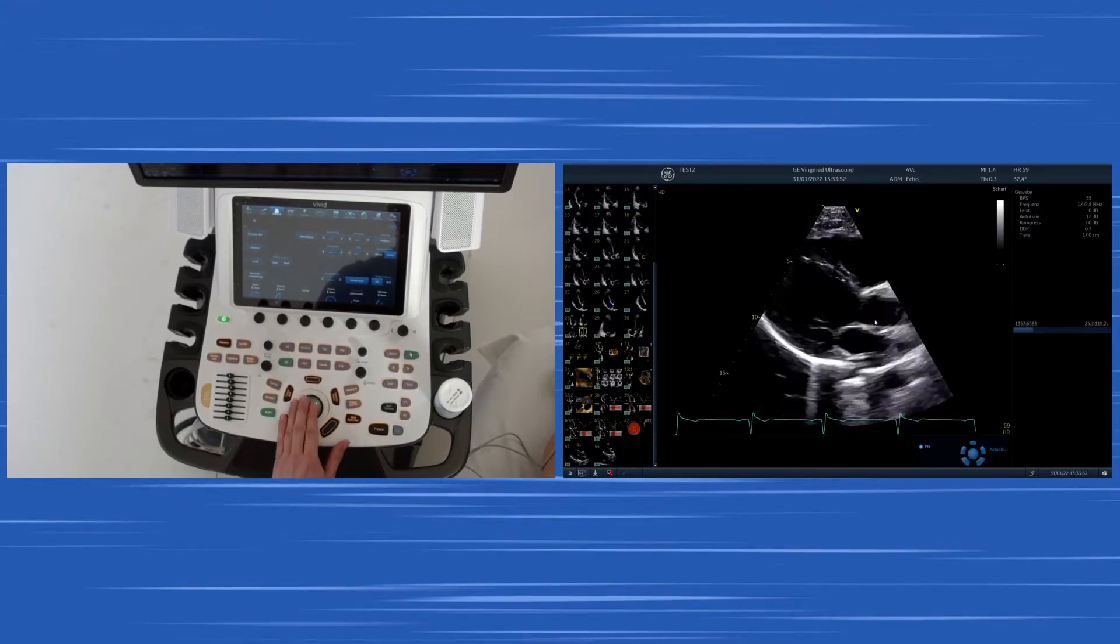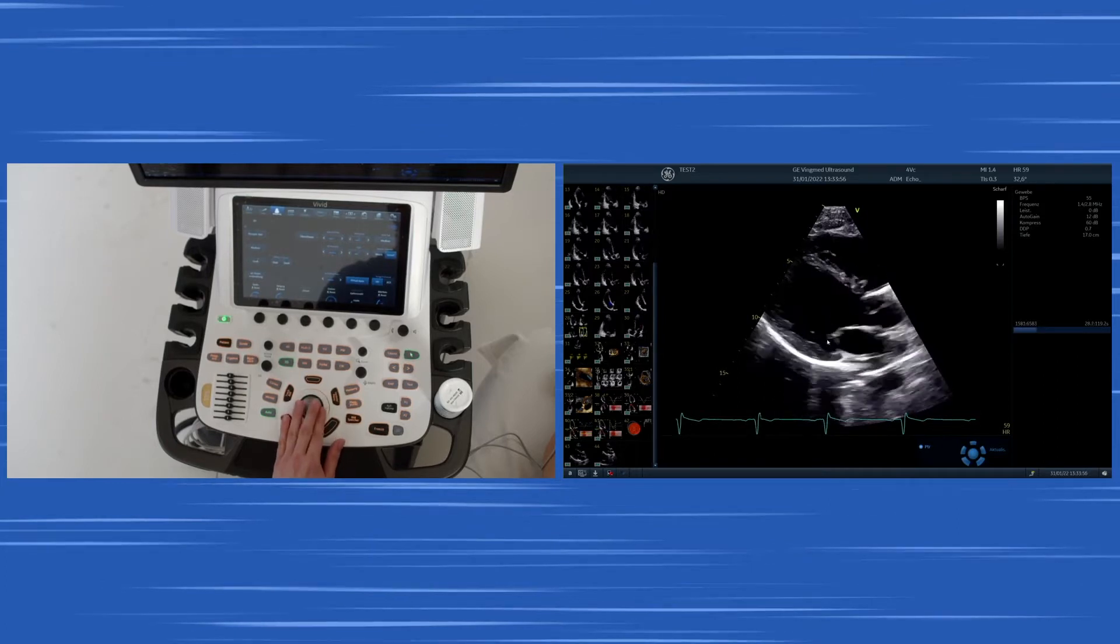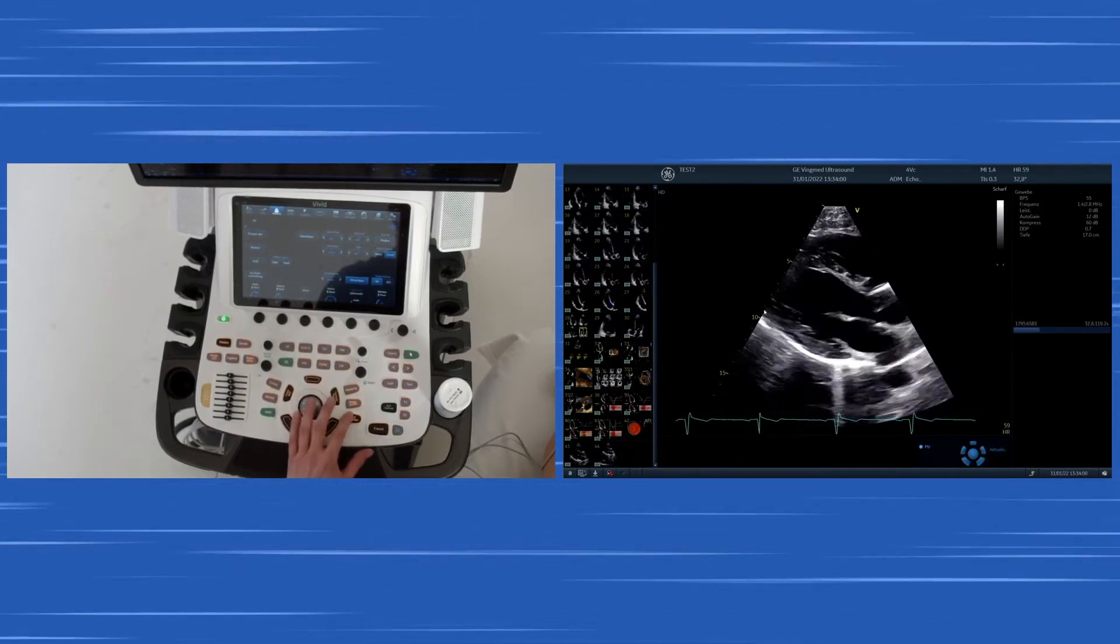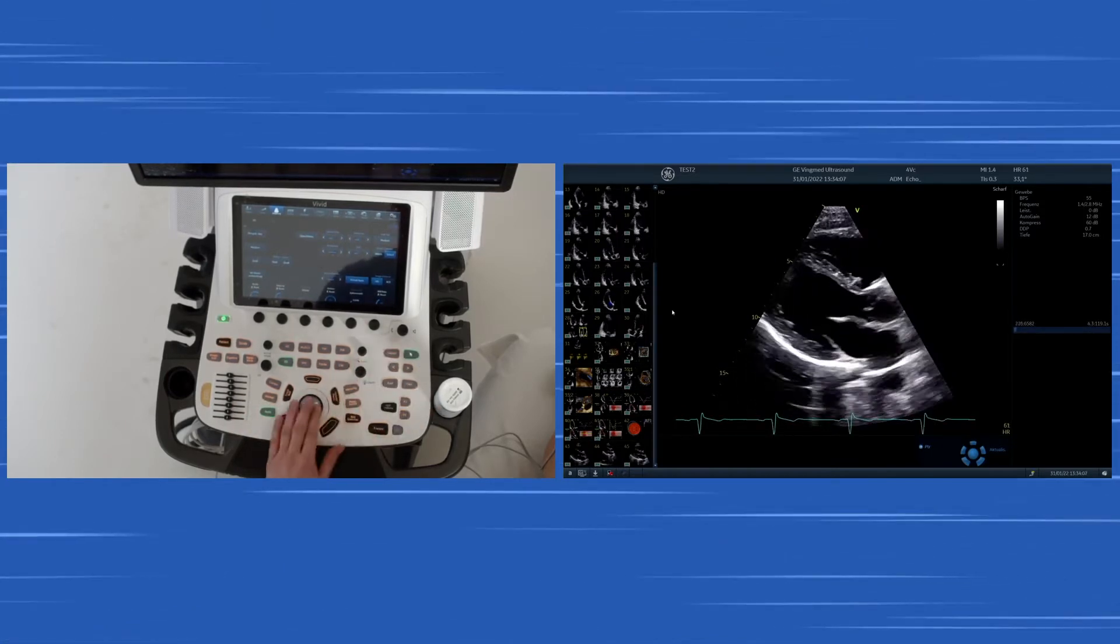Here the right coronary cusp and if we go a little bit more to the right in the image that's the aorta ascendens. This is the mitral valve, the papillary muscles. Now we go a little bit into detail of the structures.